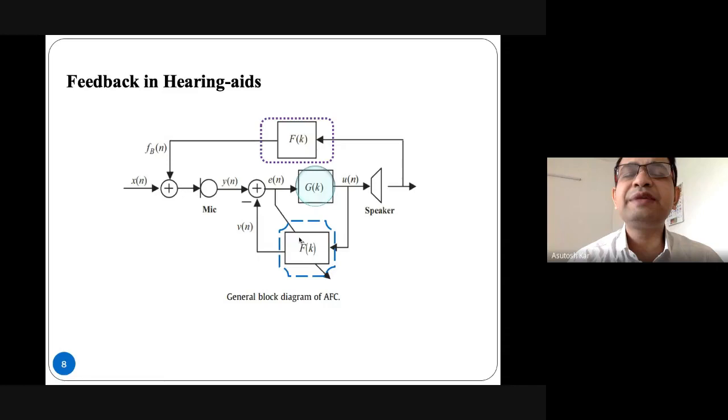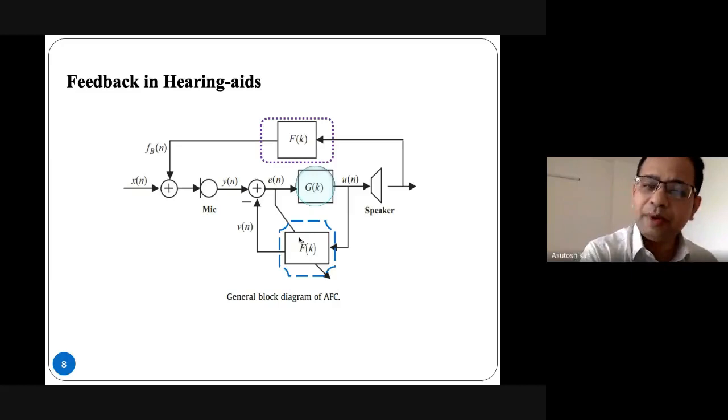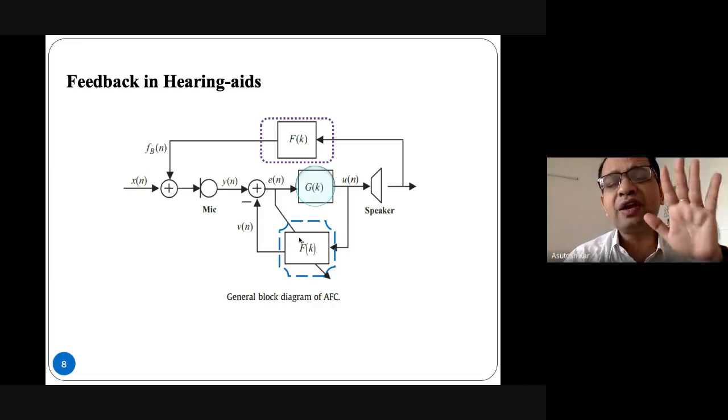So the research says this can be addressed by what? By a well-known advanced signal processing technique that is called adaptive filters. So on this, I will now go through a couple of slides about adaptive filters, because some people might know about it, some people might not. So let me tell about it. An adaptive filter can also be called an applied machine learning technique.